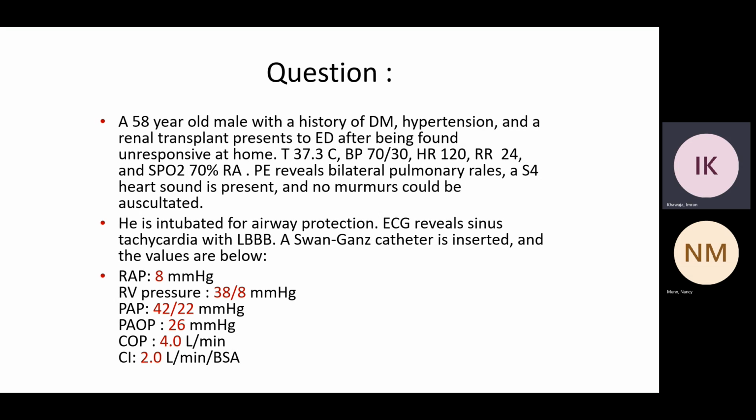Sometimes the nurse will come to you and say, hey, the systolic is good, but the mean is low. Can we just go with the systolic? And you go over to the monitor and you see it's underdamped, and the systolic is good only because it's underdamped, giving you a higher systolic. That's right. Okay, next one.